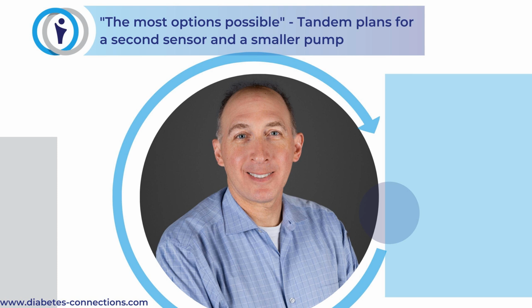Right. And I know we will see it soon enough and we'll see it in action. I'm assuming, I know you're not saying, I'm assuming it's going to be approved, but I have this mental picture for years about this little pump hanging off this dangly tube. It just doesn't seem to make sense to me. And I know that I'm probably missing something. Does it stick to the body? Does it flush on the body? You're missing a little piece, a little sleeve, a little sticker that you need to put on. You can slide it right in and you can wear it really comfortably anywhere. So it doesn't have to sit in your pocket or hang off. It's not going to be dangling from your arm.